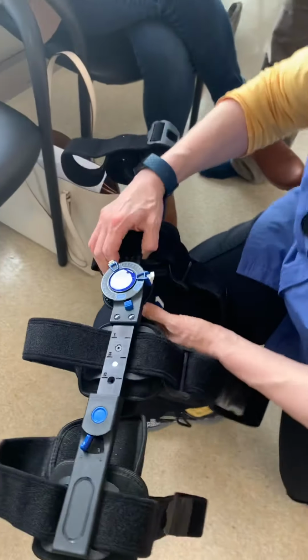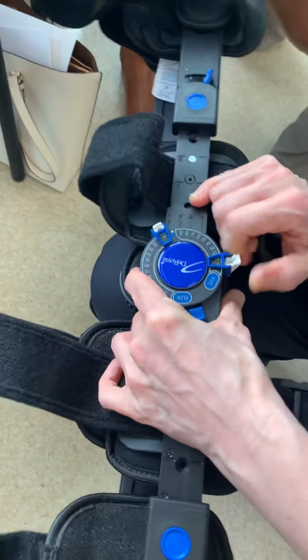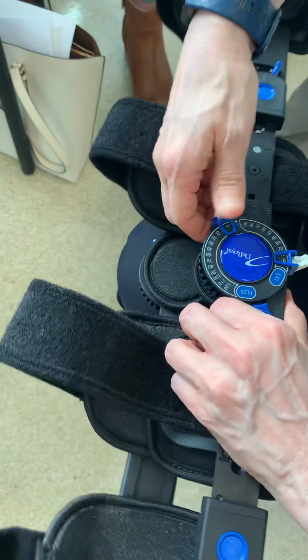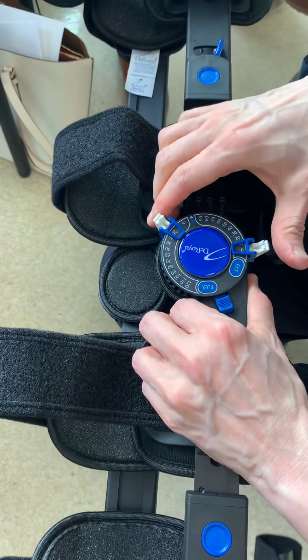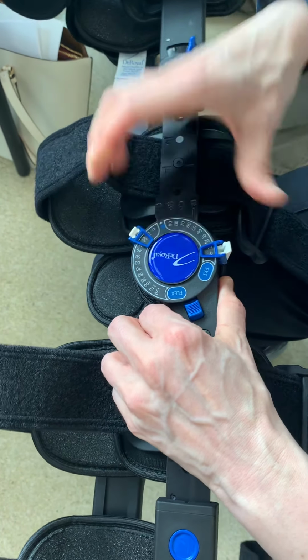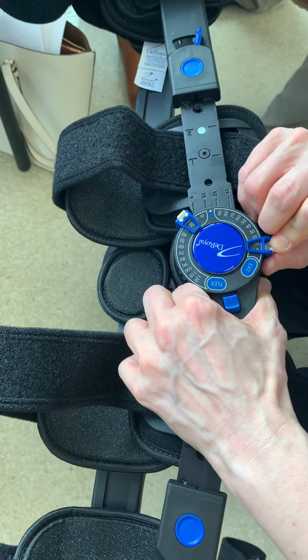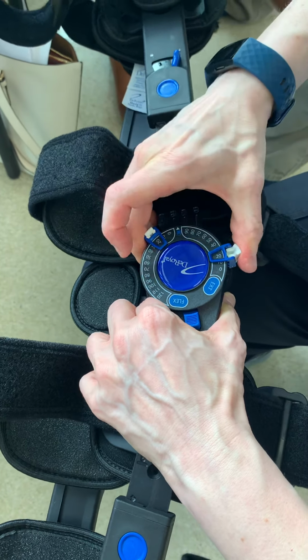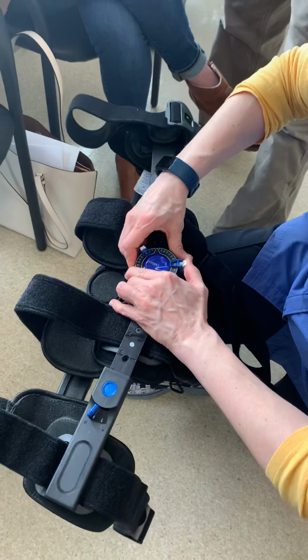So say, I wasn't kidding, I was really having to mess with this pretty hard a while ago. Sometimes you have to play with the hinge itself. You move it a little bit to where, say we're locking it at 20. I put it at 20 there, and then you can move this and hopefully move the switch over to where the 20 is in the window. And then with luck, you can get it to hook back in.